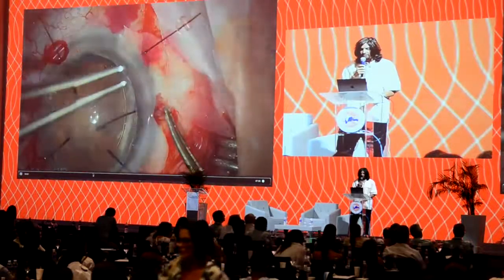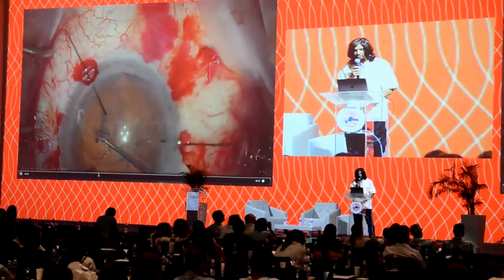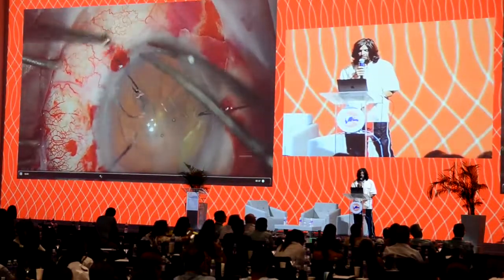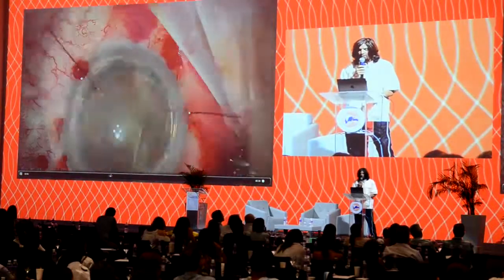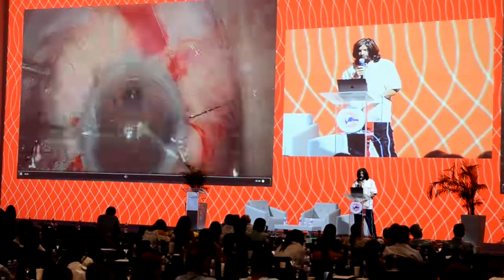Now, we have a couple of CTS capsular segments to place on the bag, placing them into the capsular equator, holding the bag in place with a couple of capsular segments. These are like coat hangers with an iris hook placed upside down. They act as retractors here. A CTR will go in, so we have the bag on lockdown. The rest of the phaco is pretty uneventful.